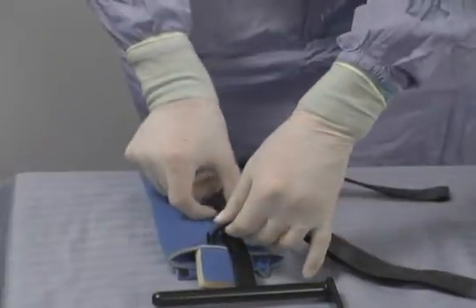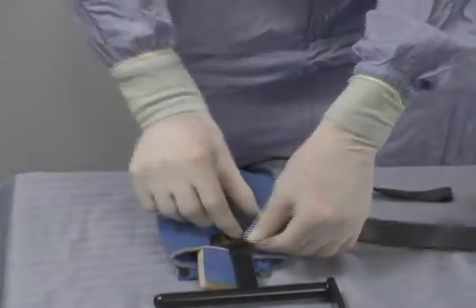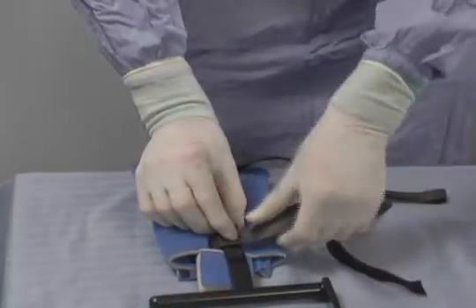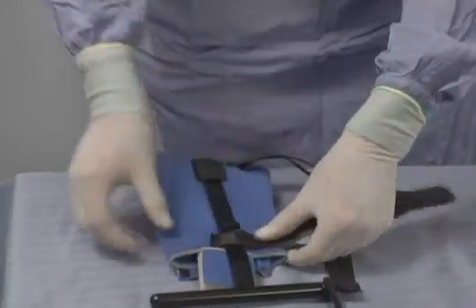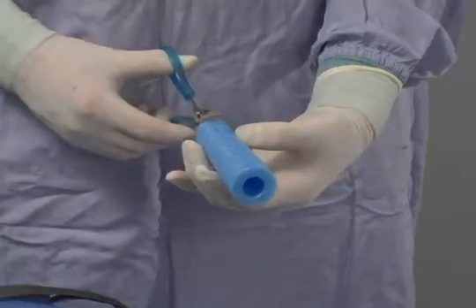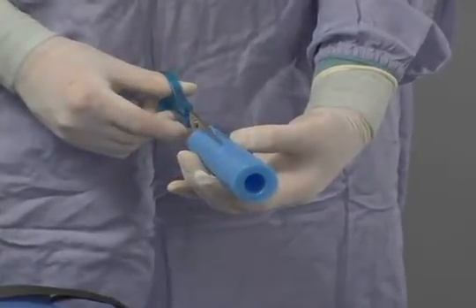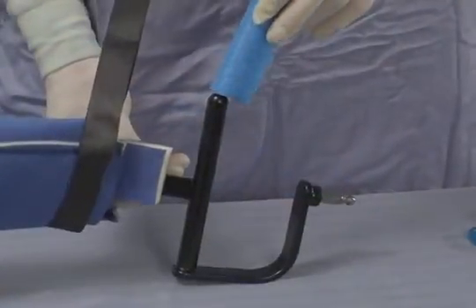First, the arm cuff is attached to the bar. The flat bar goes into the black sheath on the back of the arm cuff. Ensure that the tab on the bar is on the underside of the bar. Then the foam hand grip must be cut halfway up the groove, and it is then placed over the shoulder bar handle.